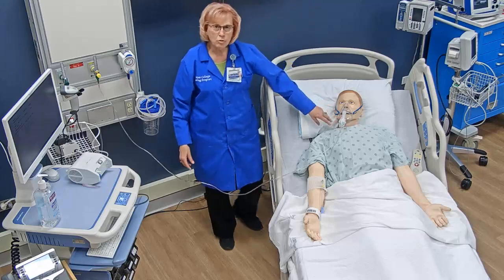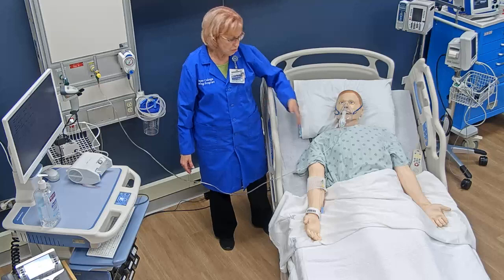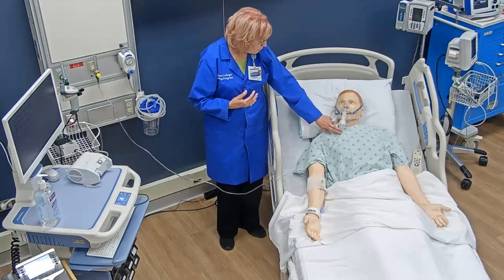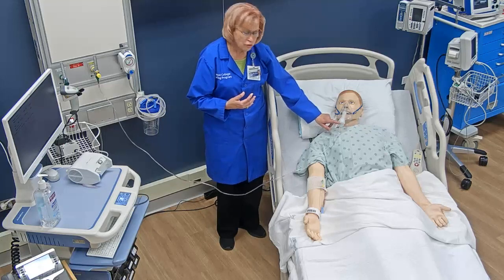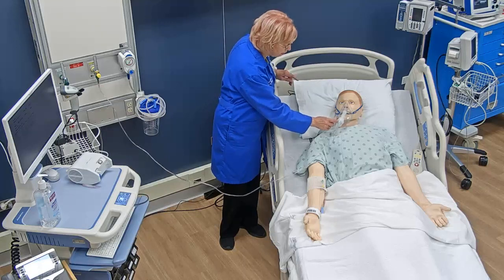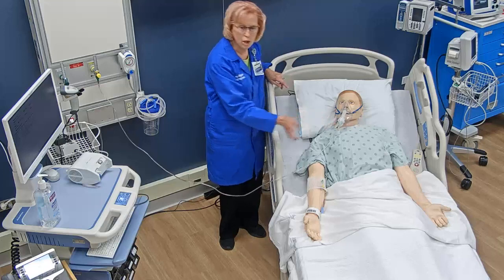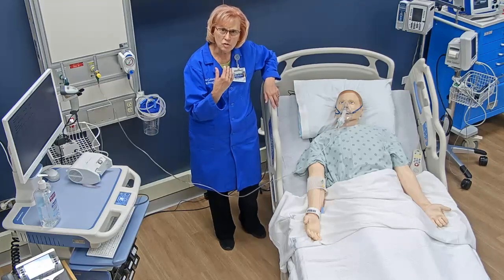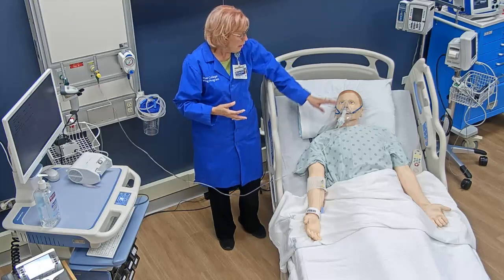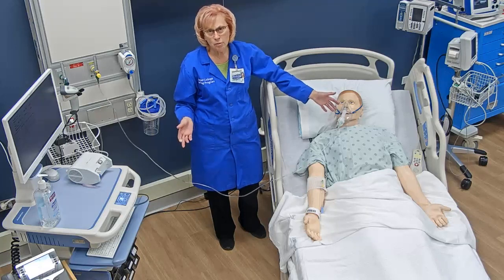And I instruct my patient, while they are getting this medicine, to take a nice slow, deep breath to try to get that medicine down into the lungs. As the medicine is being delivered, sometimes you'll notice a lot of drops collect right here. So what you can do is just give that a little tap and make sure that the liquid is on the bottom, so it'll all be aerosolized and the patient will actually receive their required dose of the medication.